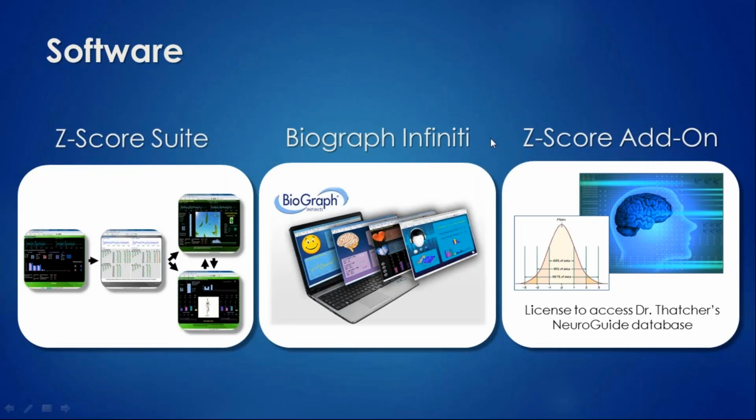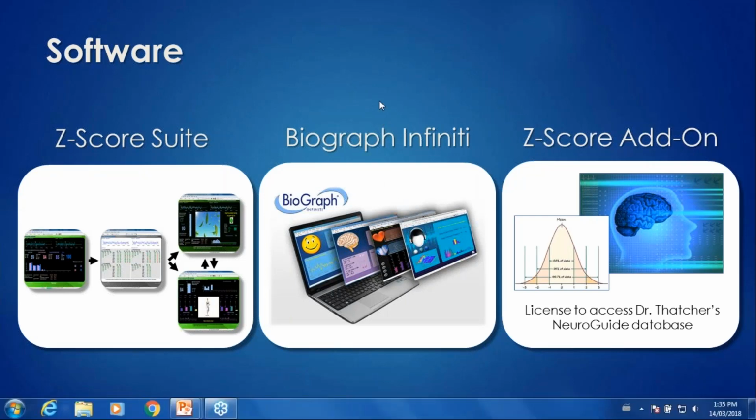You might be wondering what the costs are for these products, and I would suggest you refer back to your local distributor on what that costs, or you can also go to our website if you buy directly from us. But I do suggest you go back to your distributor first to get an idea of the prices on that.